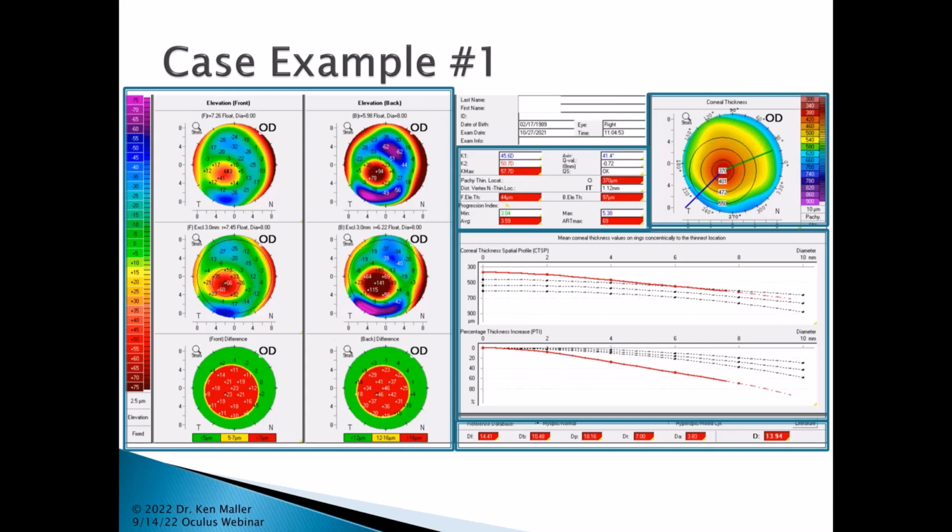The fourth one is the deviation of the minimum thickness from normal. And then the DA is the deviation of ARTmax from normal. And then what's done at the very end, that last D value, is really the total deviation of those 5 factors all taken into account and summarized into a single number.